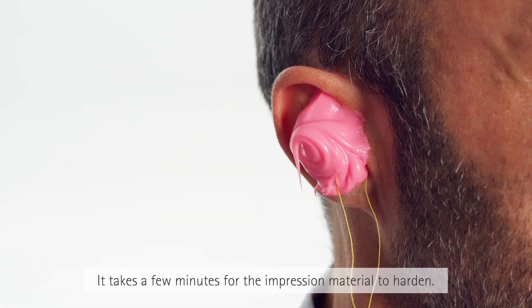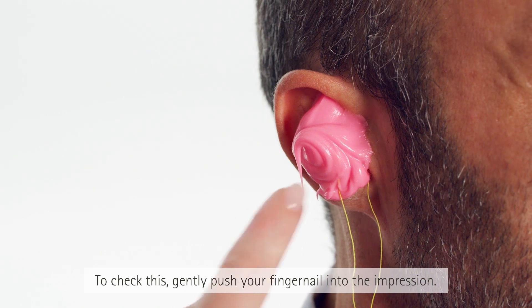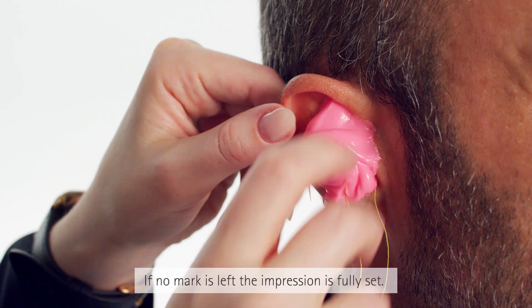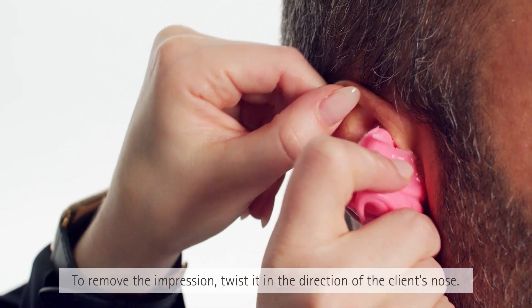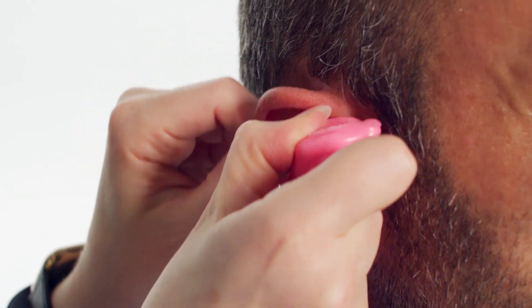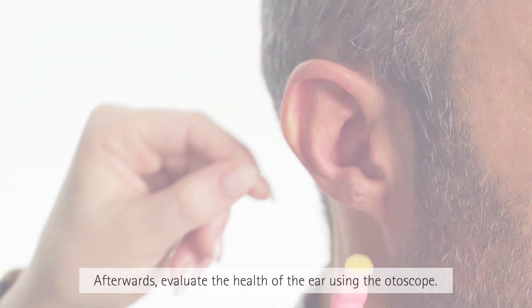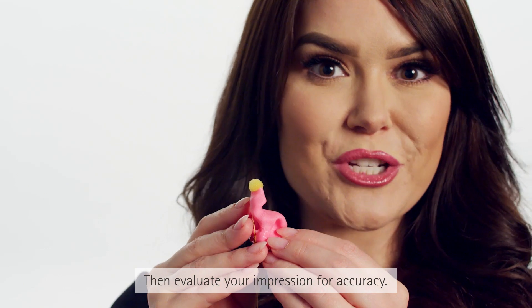It takes a few minutes for the impression material to harden. To check this, gently push your fingernail into the impression — if no mark is left, the impression is fully set. To remove the impression, twist it in the direction of the client's nose. Afterwards, evaluate the health of the ear using the otoscope.